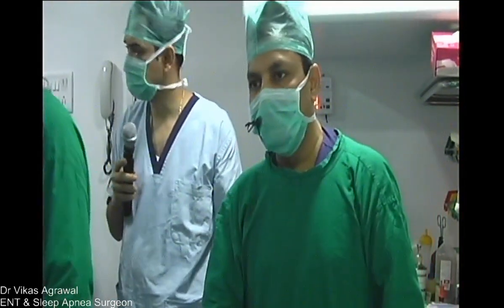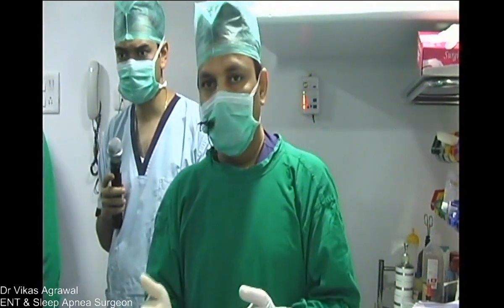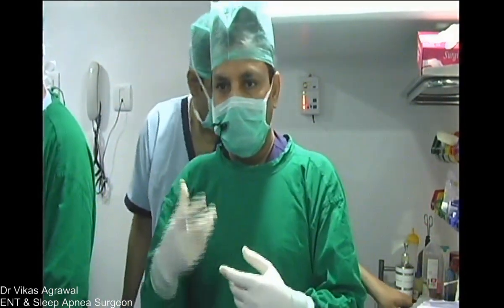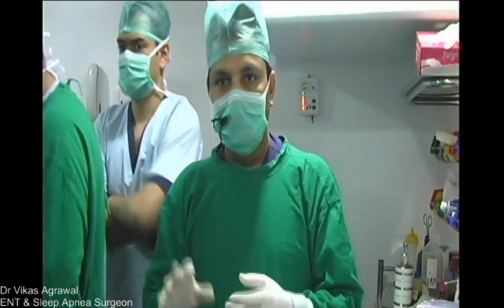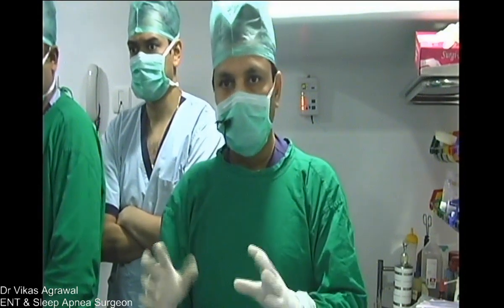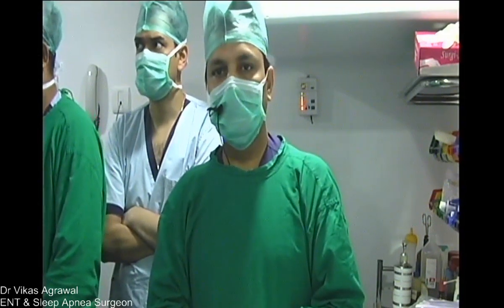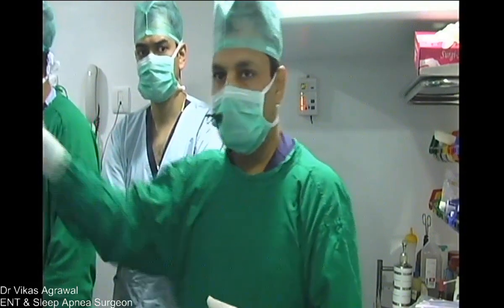See, we are dealing with obstructive sleep apnea. So if the patient comes out of deep sleep, his apnea will go away, right? If your agents keep him in deep sleep, then there's a problem. If your agents do not keep him in deep sleep, or he comes out of the deep sleep into lighter sleep, then it will stop obstructing. So if he comes out at a BIS of 80, 90, then you know that he's not going to obstruct on his own.